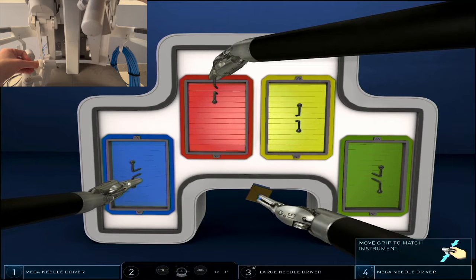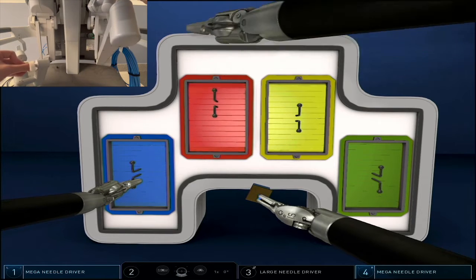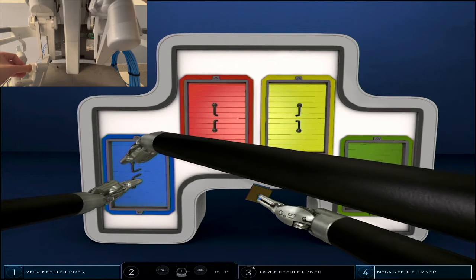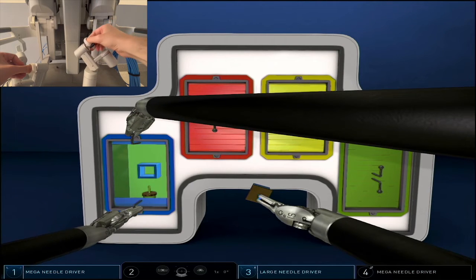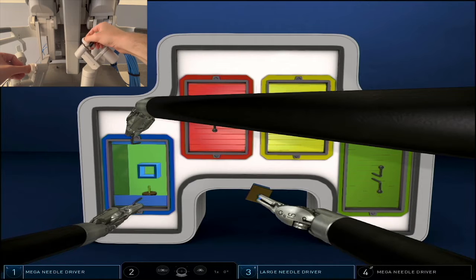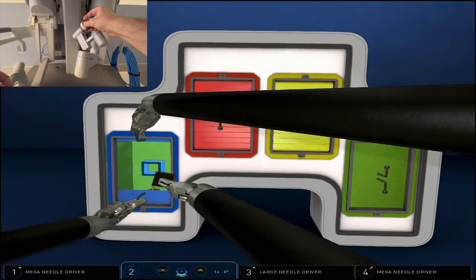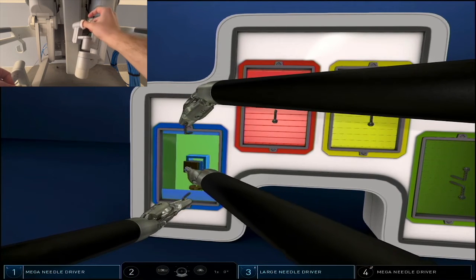Again, as the three arm relay exercises get a bit more complex, you're going to have a little bit more difficulty managing all three instruments at once. The exercise is not going to take points away if you take a little bit more time to reposition your instruments.